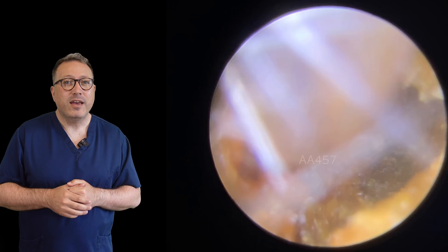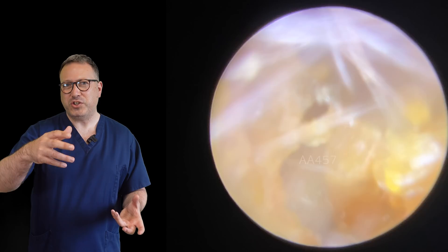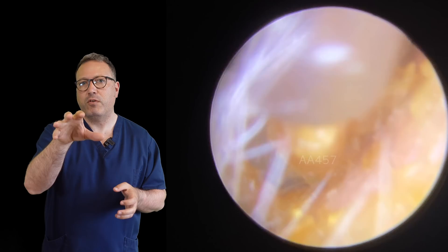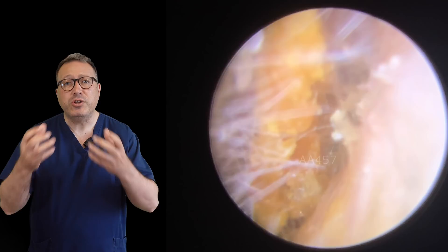We're just lifting now from the sides. With this type of problem and keratosis obturans — a specific condition where you get this excess skin debris which interweaves — it's very, very similar to this. I think if this had gone unchecked, it could develop into that kind of problem. But with this particular patient, because they just started experiencing that change in hearing and a little bit of fullness in the ear canal, it hadn't quite got to that stage. There's a nice long strip of skin there — that's what was anchoring that last piece in place.